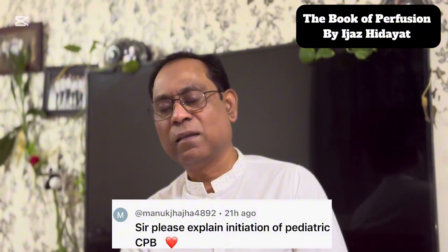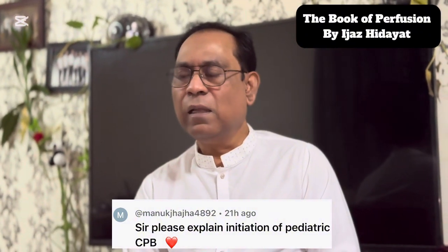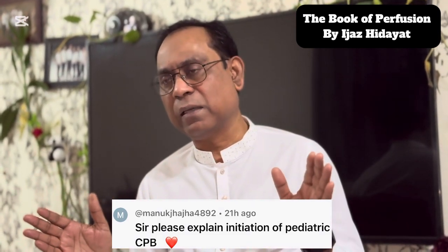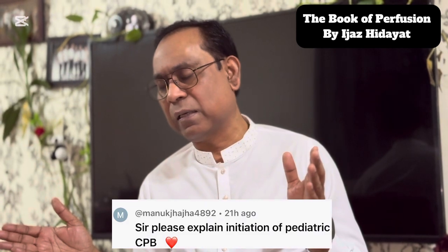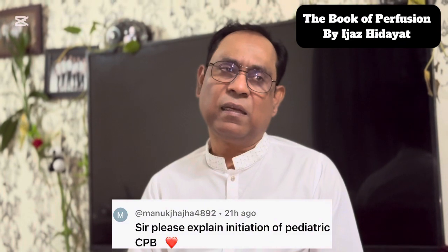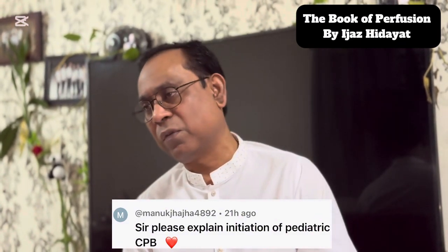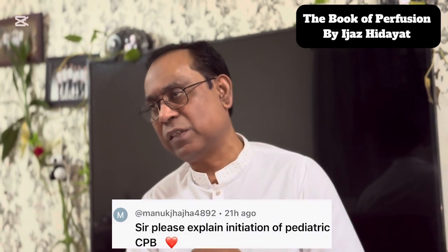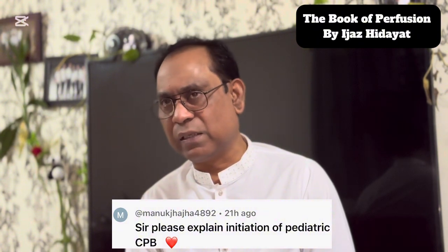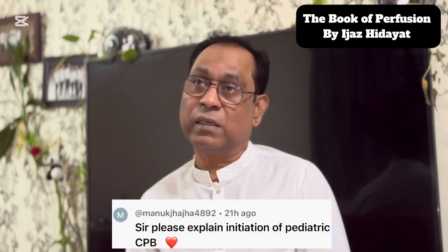Question is: sir, please explain initiation of pediatric cardiopulmonary bypass. See, for adult cardiac surgery initiation of bypass and for pediatric cardiopulmonary bypass initiation we have a different way and strategy to keep yourself ready as a perfusionist. Of course, we have to calculate the body surface area of the patient from the height and weight, and then we find out the calculated blood flow.